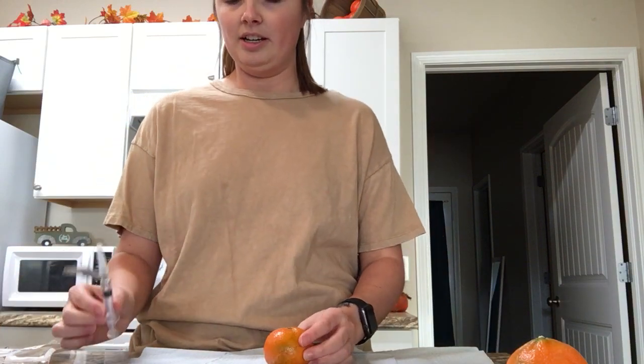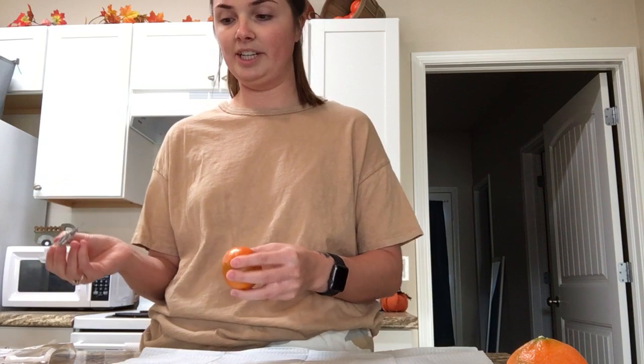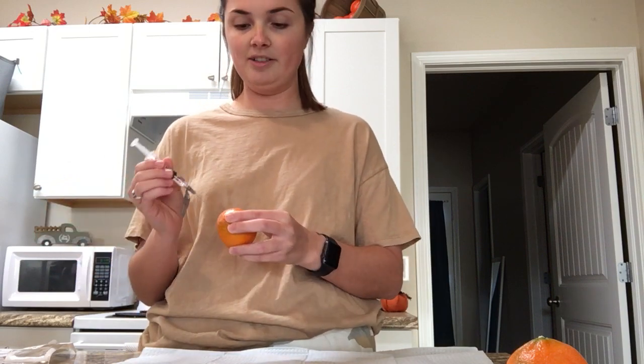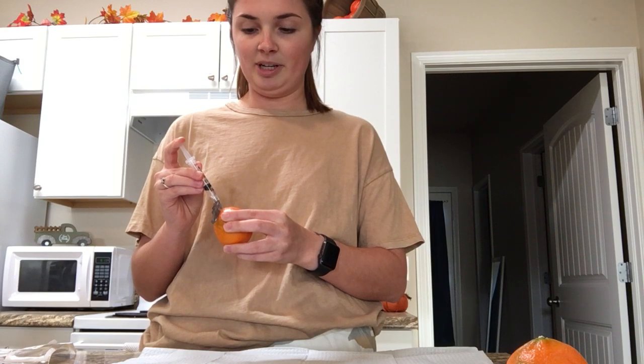So then I'm going to take the medication, and wherever I'm injecting it, I'm going to pinch the skin, and then I'm going to tell the patient to take a deep breath, and then I'm going to dart the needle in and insert the medication.